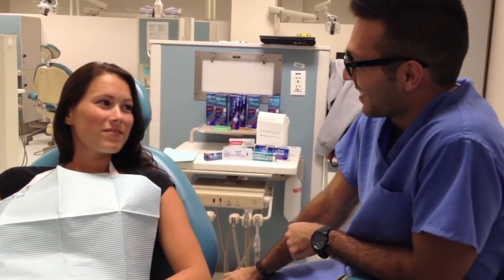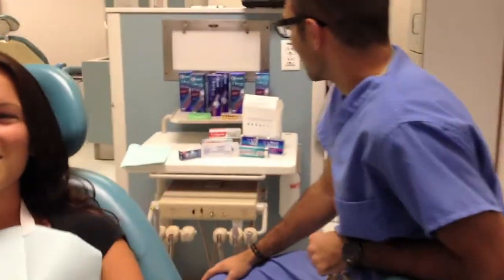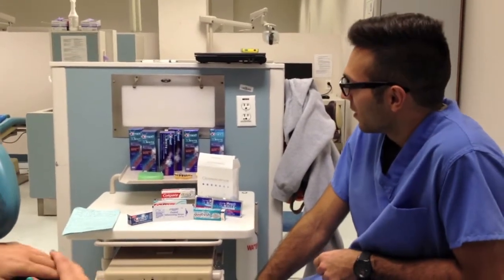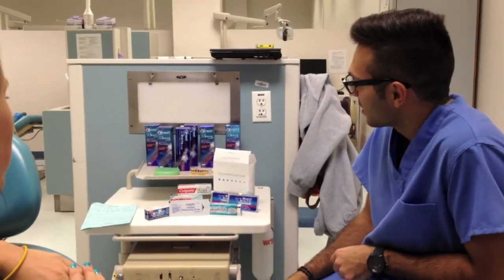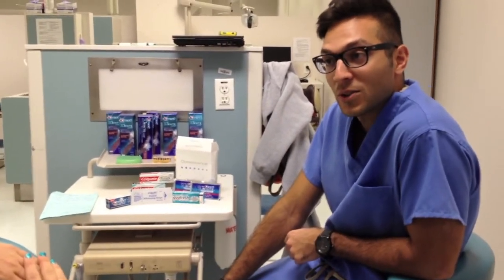Does that sound like a good idea? Great. Right here we have a multitude of tooth whitening products that you can choose from. We have our toothpastes. We have our tooth whitening kit for the home, which actually might be a great alternative.